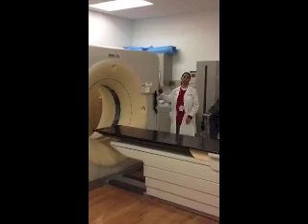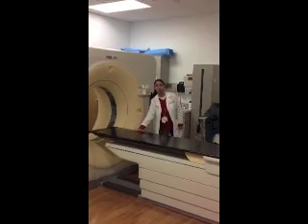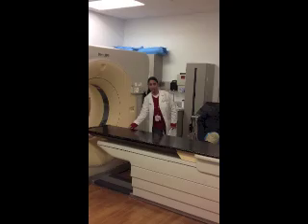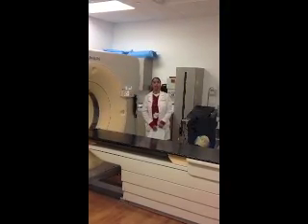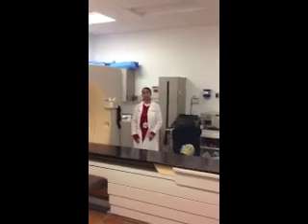For a course of whole brain irradiation treatment. First few points I want to point out prior to starting is that this is a CT simulator. It's different from a diagnostic CT scan in that it has a carbon fiber table, which mimics the treatment table that the patient will be on during their course of radiation treatment. And also, in a minute when we show the software, it has a different type of software that mimics the radiation treatment machine. So the first thing that the patient will go through is what we call a CT simulation.